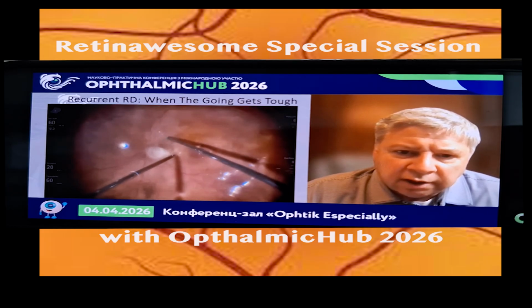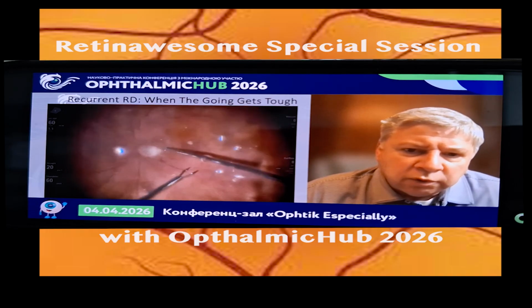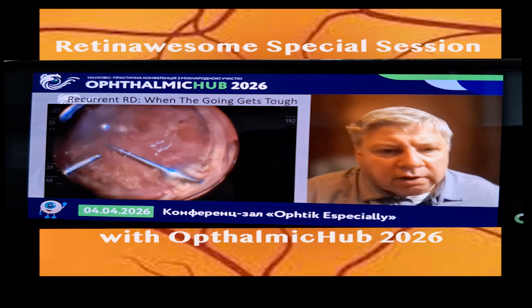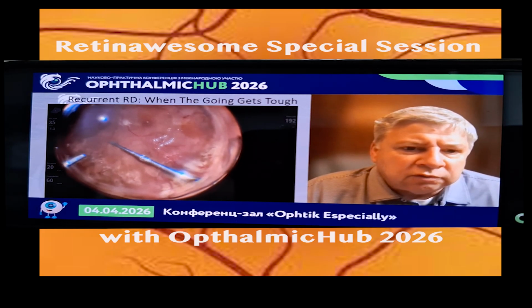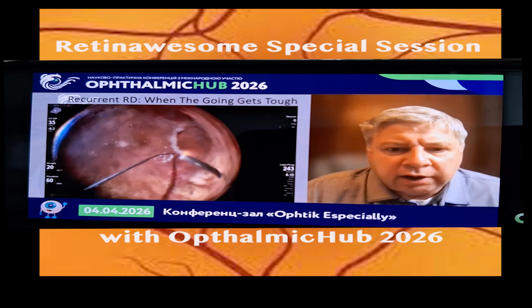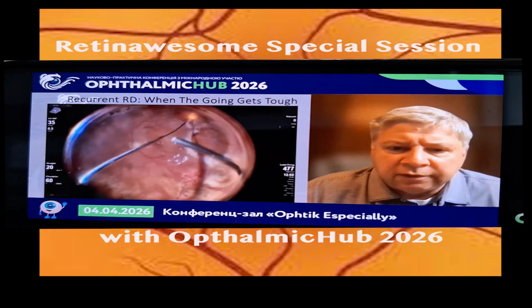And on this case, here we're positioning the patch graft. We left this patient under perfluoron for a couple of weeks, and then we switched to gas.